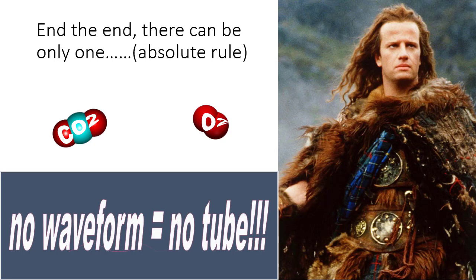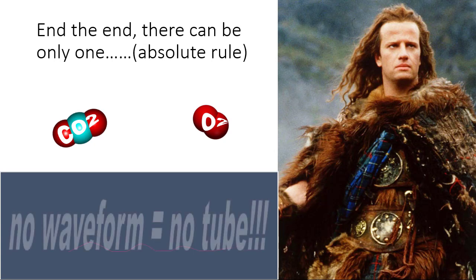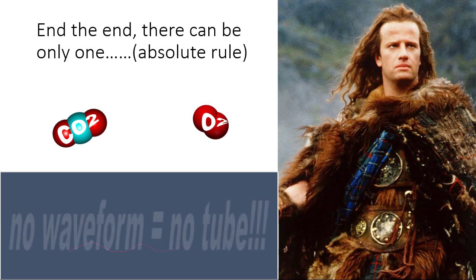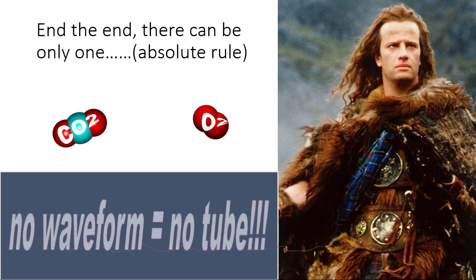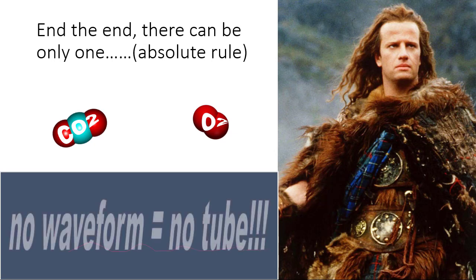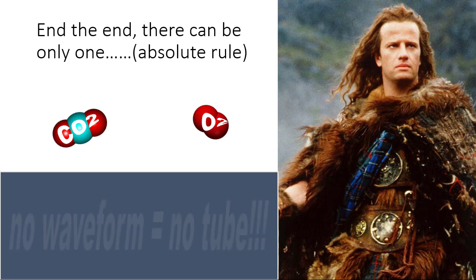So in the end, there can be only one. In other words, one absolute rule, and that is you have to have end-tidal CO2 with your waveform. No waveform, no tube. No waveform, no tube. Doesn't matter what else you think you got. And the reason why I say that is that 23% missed tube, unrecognized gut tube rate with no end-tidal CO2. Remember that 23%? I doubt those medics said, it's a gut tube, I don't care. They all thought they had it in place. They all probably, presumably, did other methods of confirmation and still missed it.